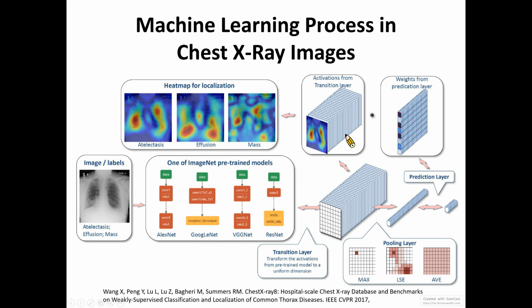And also, around the world, there are many teams trying to develop practical applications of machine learning on X-ray or CT images. This is one of the applications, called InferVision. It can identify objects in CT scans of the lung fields and identify masses or pneumonia lesions. This is also a company from China. They have already developed an algorithm to make diagnoses from CT images.